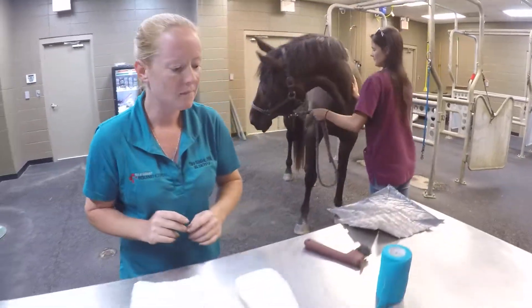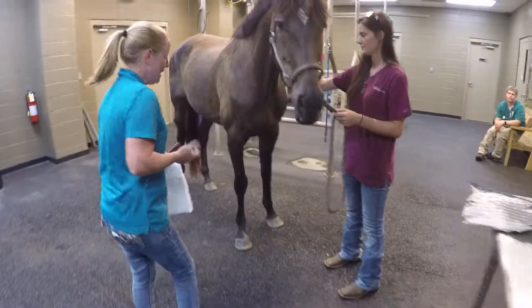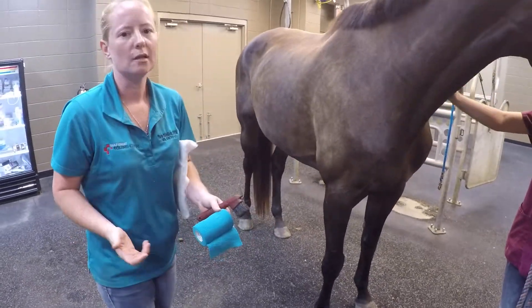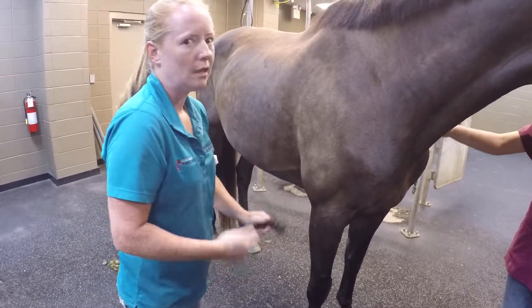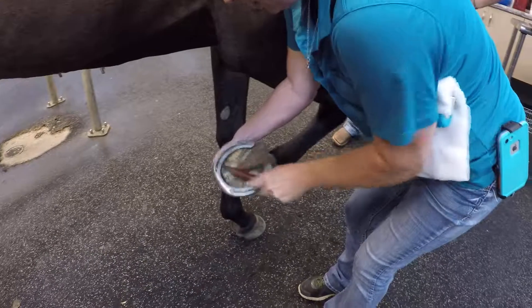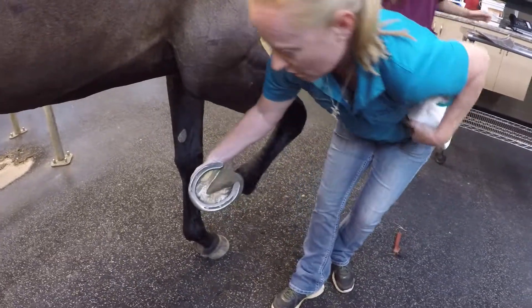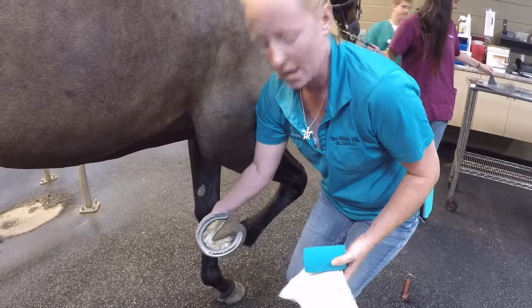We're gonna go ahead and wrap up this horse's foot right now. First thing you want to do, even if you've had a foot bandage on your horse, is make sure that the bottom of their foot is nice and clean. We don't want to track a bunch of dirt in there if they managed to walk through the bottom of their bandage and got a little bit of shavings or mud into that bandage. You want to clean up the bottom of that foot. This one's pretty clean, but just make sure that stays clean so you're not trapping anything extra in there with a hoof abscess or a wound.